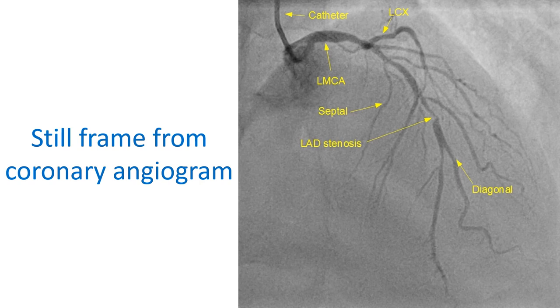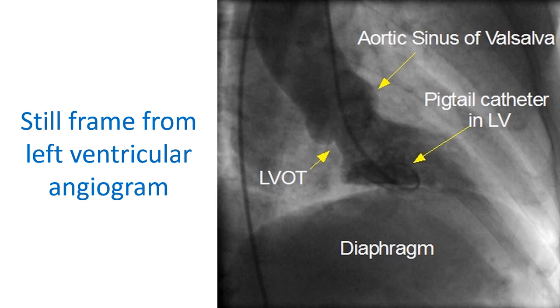One of the commonest forms of angiography is coronary angiography, the visualization of blood vessels of the heart. This is used to detect blocks in the blood vessels and to assess their location and severity. Visualization of the lower chambers of the heart by injecting radiocontrast medication is known as ventriculography. Angiogram of the aorta is known as an aortogram. Blood vessels of the lungs are seen on pulmonary angiogram.